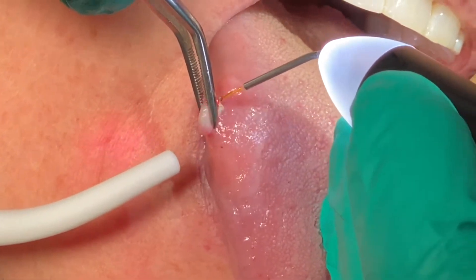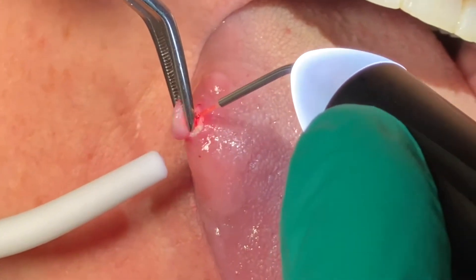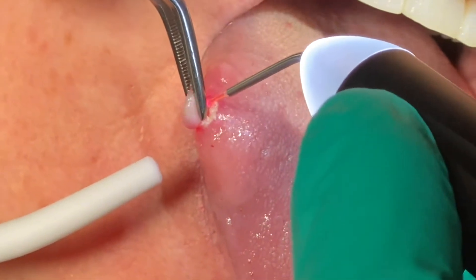Once I go ahead and start cutting, the fibers will start to separate, and this will go ahead and kind of come off probably in about 15 seconds.